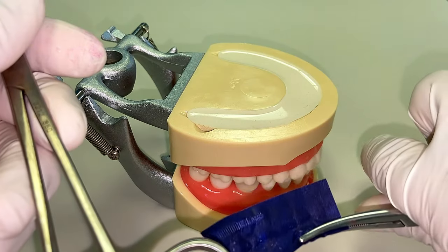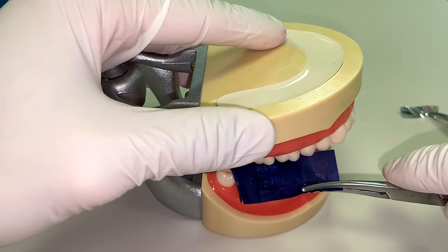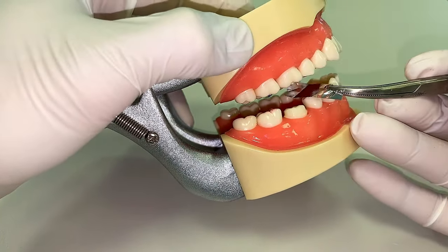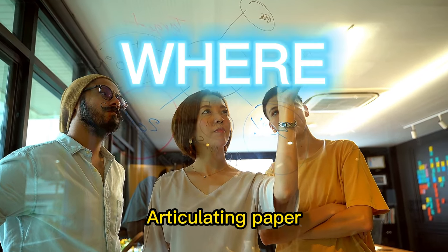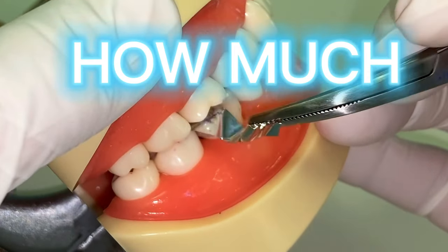Tip number eight: articulating paper is standard to check the bite — we all know that. But shim stock is really helpful to figure out if the crown is exactly in occlusion, high, or non-contacting. As Dr. Yard used to tell us as residents, articulating paper will tell you where the contacts are and shim stock will tell you exactly how strong the contact is.